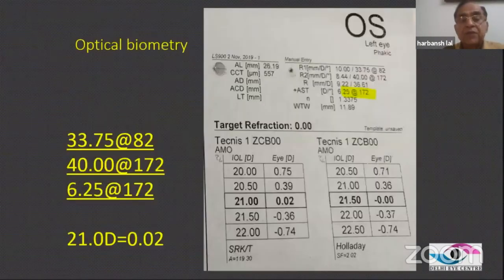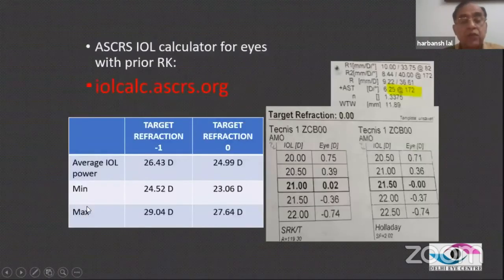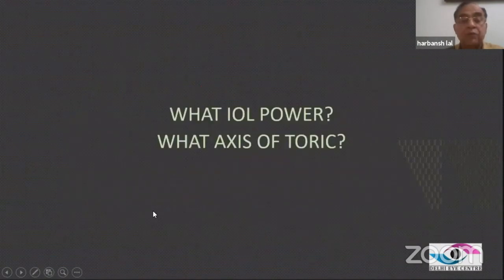This is another patient. If you see, the cylindrical power was 6.25 diopter, but axis was 172. And on a Pentacam, the cylindrical power was the same, but axis was 149. So there's a lot of variation in the axis of the two. And then if you see the biometry value was 21 diopter, if you put on a minus one, the maximum we were getting was 29 diopter. So there's a huge variation. And we need to go by this reading instead of this 21 reading. Otherwise, we will land up with a lot of hyperopia.